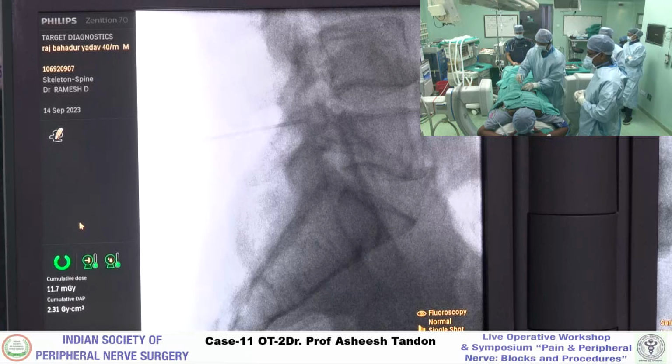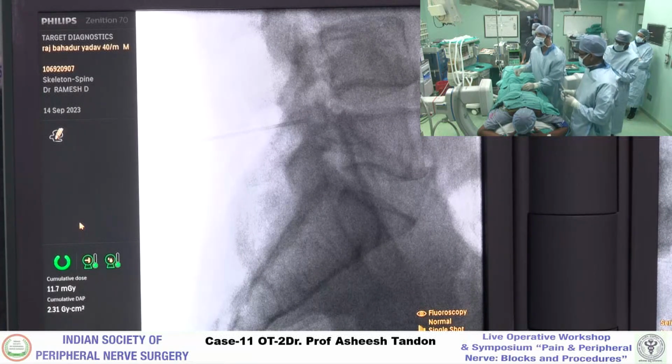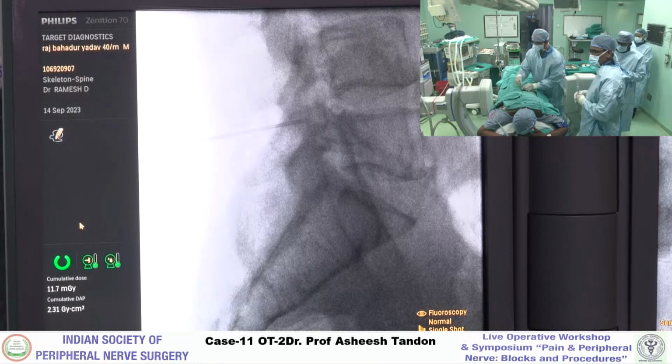So you're inside epidural? Just about. Not yet. And I don't think we were inside at that time either.